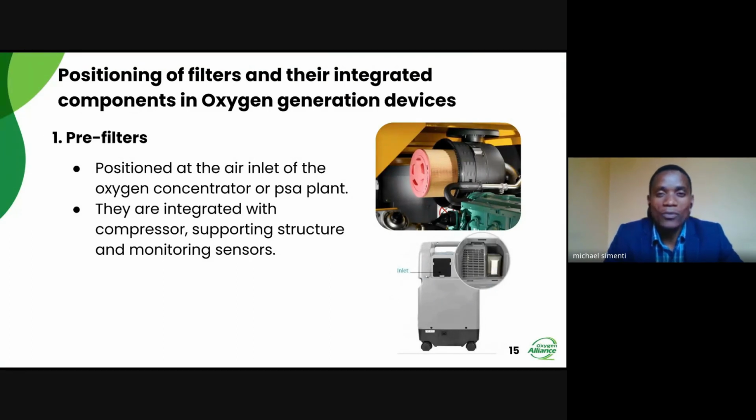And we have also some other components like sensors. Some devices, especially the oxygen concentrators, are sometimes incorporated with oxygen monitoring sensors. The reason is to check the condition of the filter. So if the filter is clogged or is having some issues, those sensors are able to send the information to the user, whether it be the user, the nurse, or the engineer.